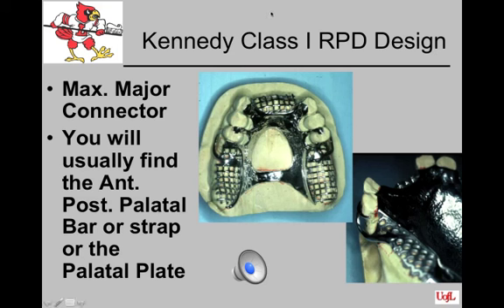The anterior and posterior strap must be a minimum of 8 millimeters in width. The anterior border should avoid the speech zone at its borders, and the posterior strap cannot extend posterior to the vibrating line, or food and debris and water will get up under it. The hole must be at least as large as a nickel in the palate, or it should not be placed. A hole in the palate that is smaller than a nickel is actually very annoying to the patient.